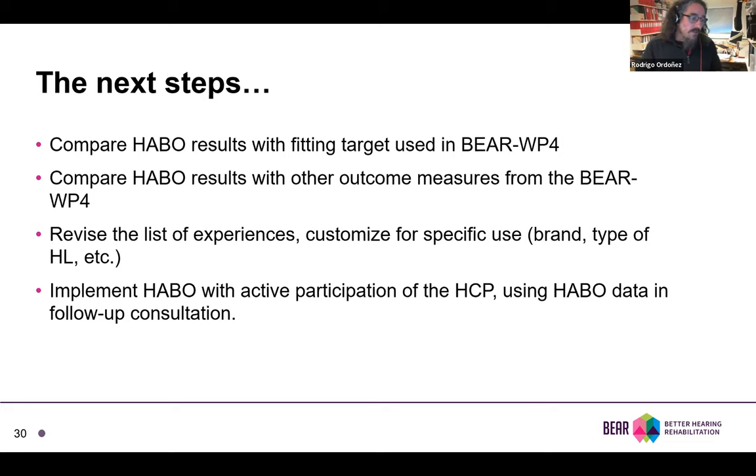Of course, implement the system with the active participation of hearing care providers so that we can provide feedback during the acclimatization phase, but also so that we can develop the tools that the hearing aid providers will need in order to use this data. Because the things I've shown you are basically how I can best visualize data. I don't know if that's what hearing aid providers will need in order to improve the fitting.